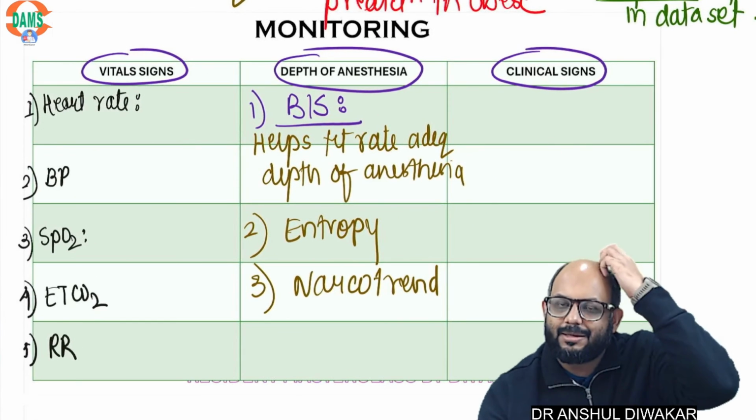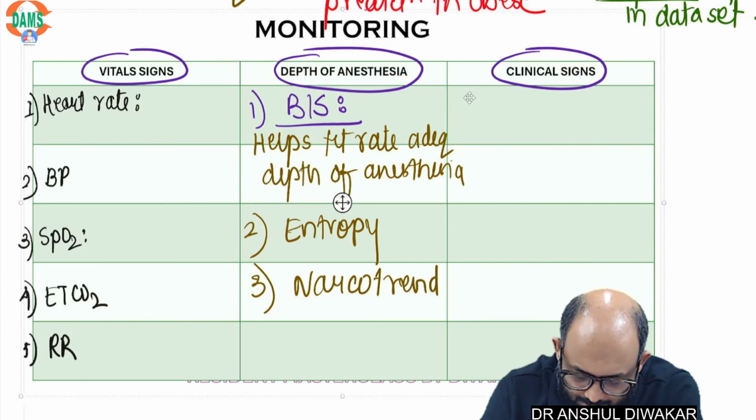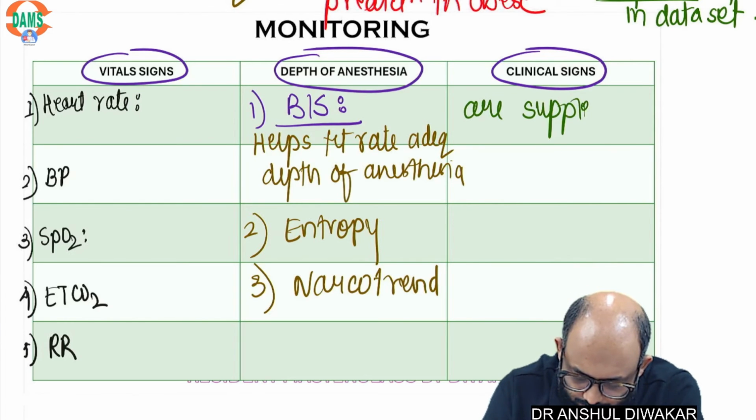And finally, clinical signs, which are supplementary to electronic monitors.